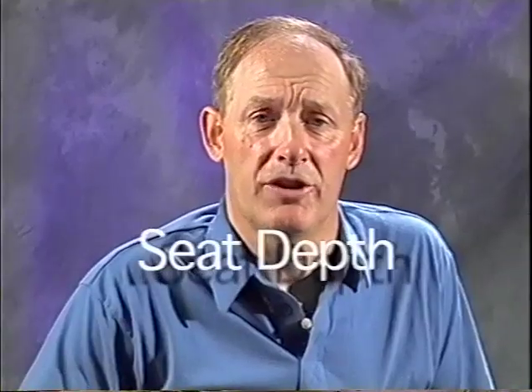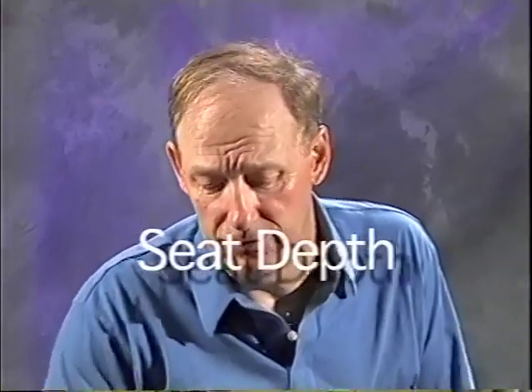Seat depth is the next piece of the chair that we'll look at. The general rule of thumb is you want the seat to be long enough to support your legs, yet short enough to get your hands behind your knees. And there are a few things you can do to cheat with seat depth, which is basically changing your cushion, going with a little bit longer cushion or a little bit shorter cushion.